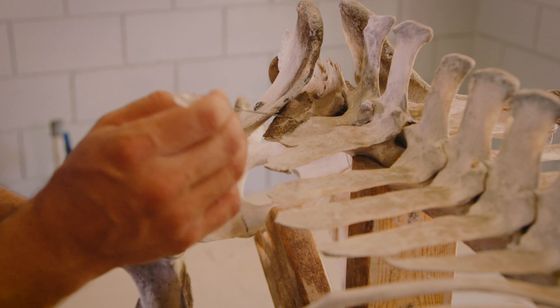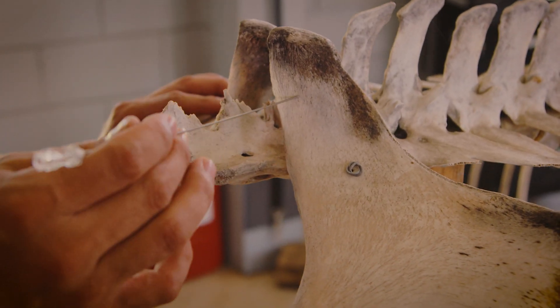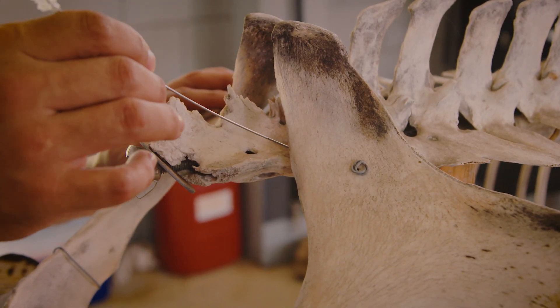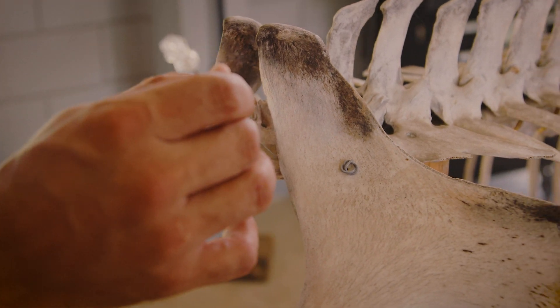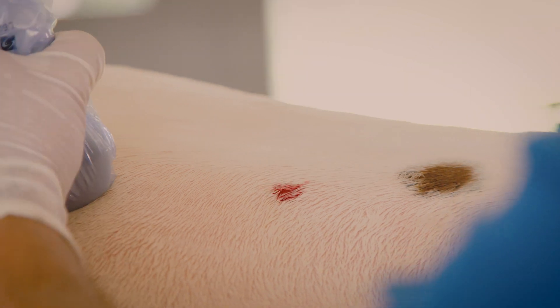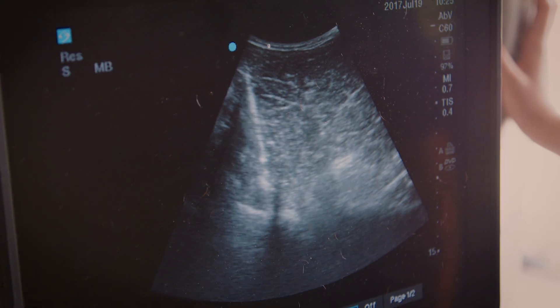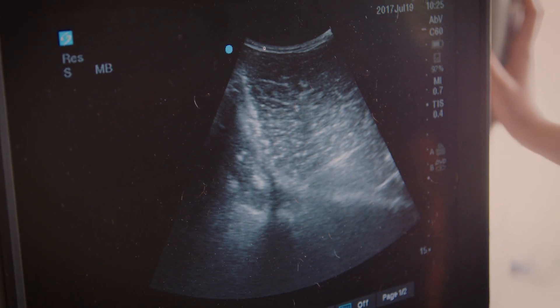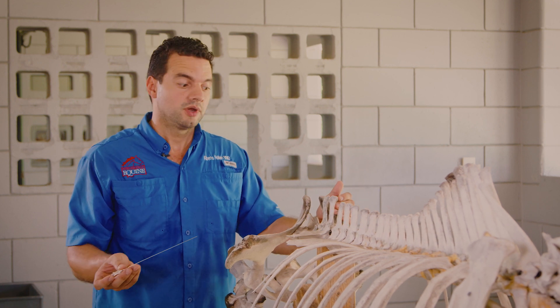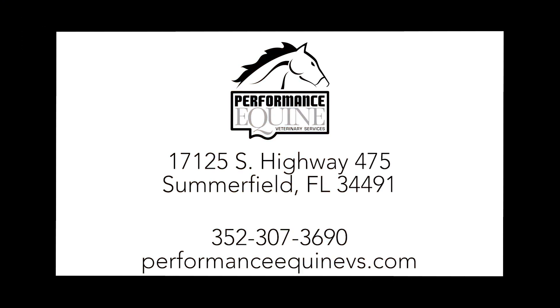This is the cranial part of the sacroiliac joint because it's towards the front. If you come back, this is the iliac part of the pelvis and this is the sacrum — so this is the caudal part of the sacroiliac joint. Guided with the ultrasound, we have 100% guarantee that we put the product in the place it needs to be. Back in the day we used to do this blindly without ultrasound — probably 50 to 60 percent of the medications were placed somewhere else. Now with ultrasound, 100% of the medications go exactly where they need to be.